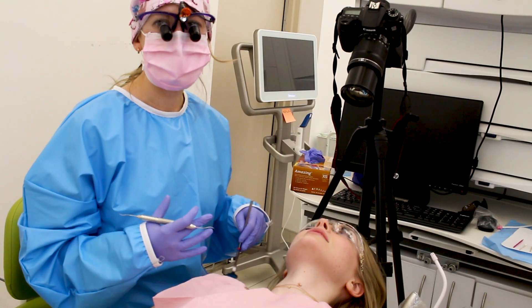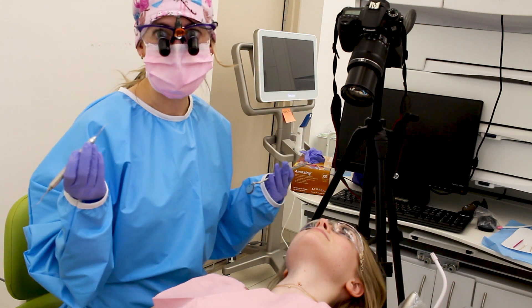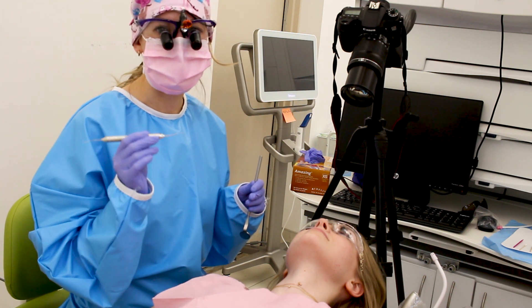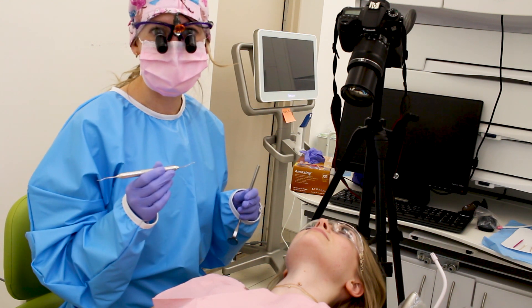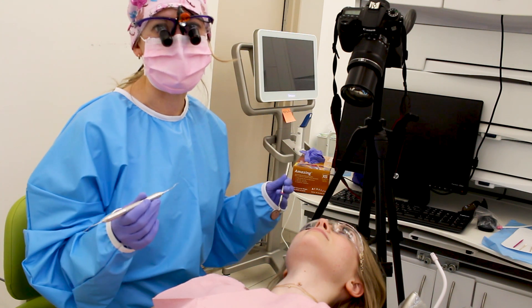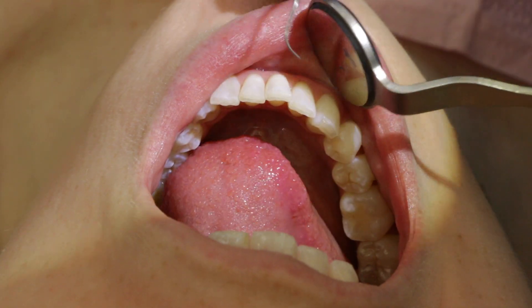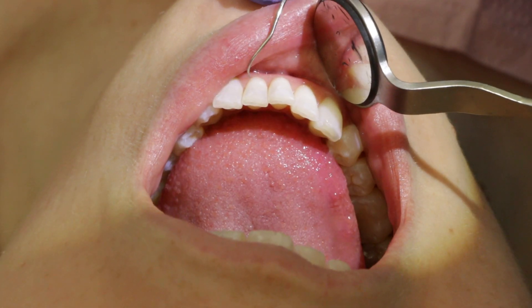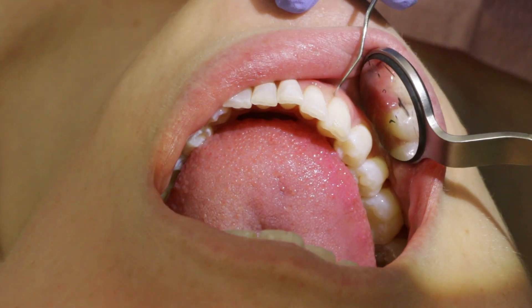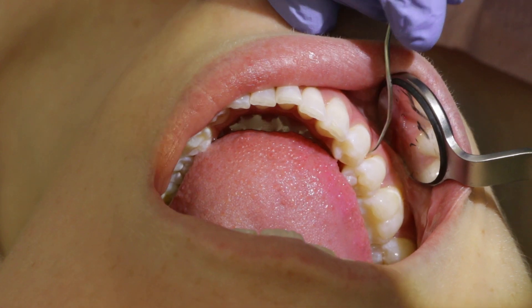At any point during the cleaning your hygienist might stop and re-evaluate — she might pull out a periodontal explorer. This is used to help find any spots of calculus still remaining or tartar buildup on the teeth. It's basically like a really tiny finger — you feel around the tooth for any spots it might catch, and wherever it catches lets us know there's still something stuck on the tooth. We do a quick check of that around the full mouth.